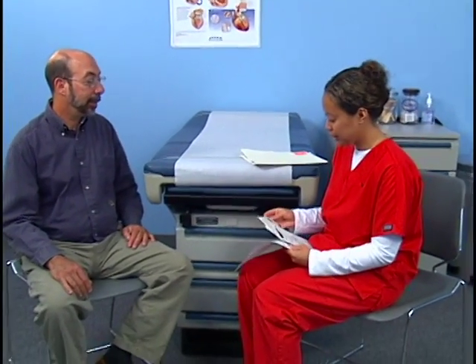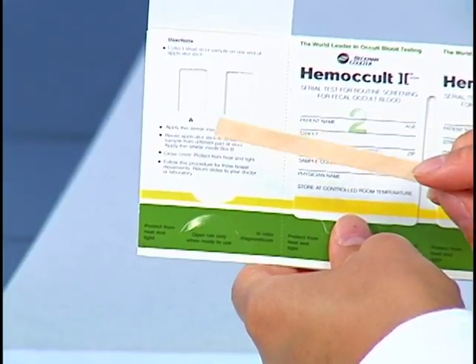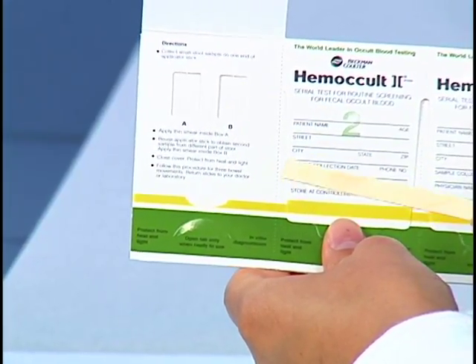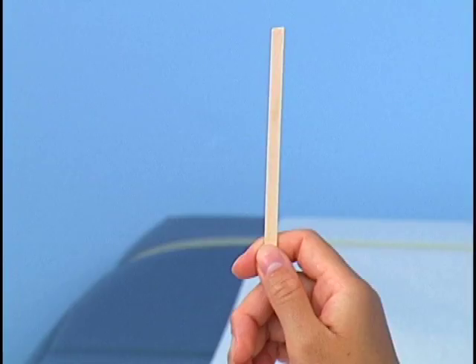The kit consists of 3 identical cardboard slides attached to one another. These are to collect 3 stool specimens on 3 different days. Instruct the patient not to tear the slides apart. Each slide contains 2 squares labeled A and B. They contain filter paper impregnated with Guaiac, a chemical necessary for detection of blood in the stool. The kit also has 3 wooden applicator sticks and written instructions.